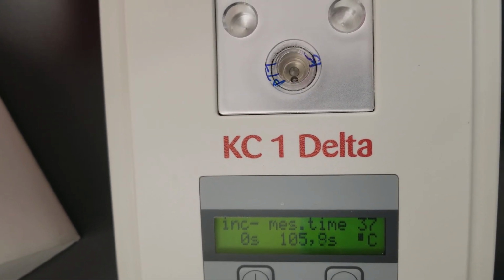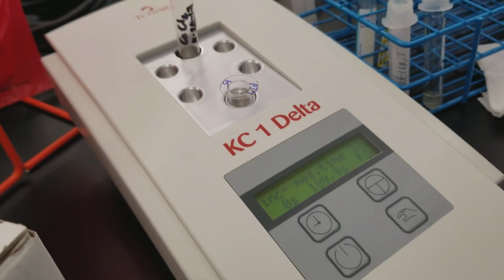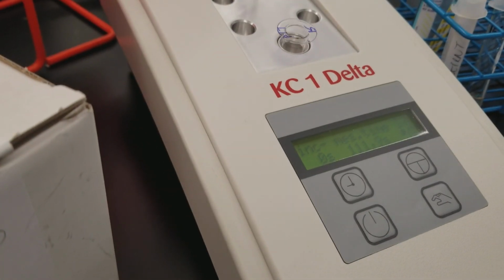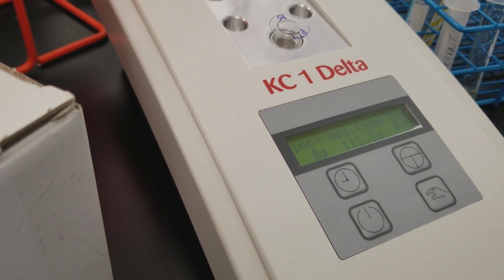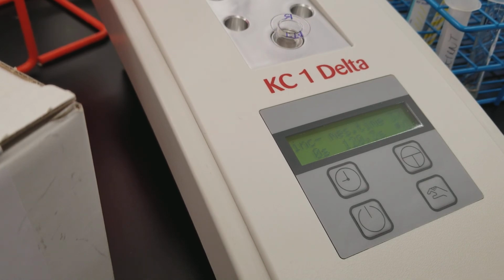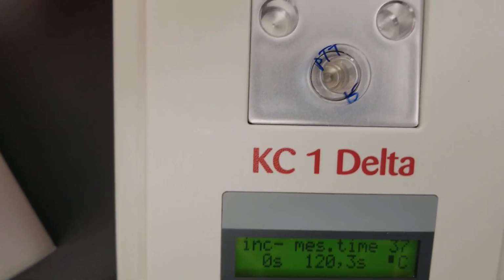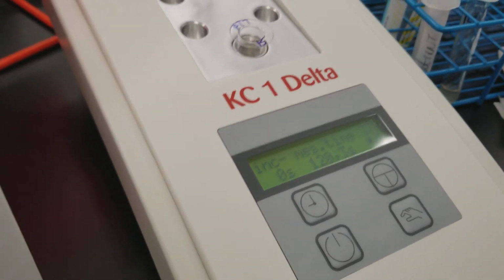You can basically stop at this point. Since it's over 100 and it's still going, we would report it as greater than 100 and it would be a critical. We would call up. Oh, it finished. We would call and report it to the patient's nurse.